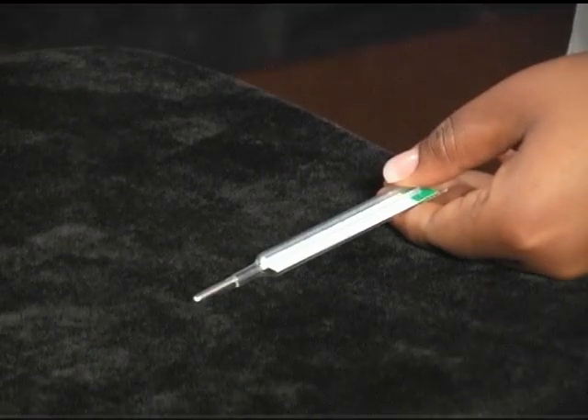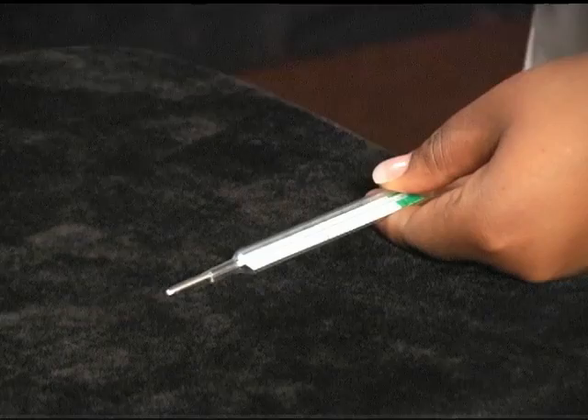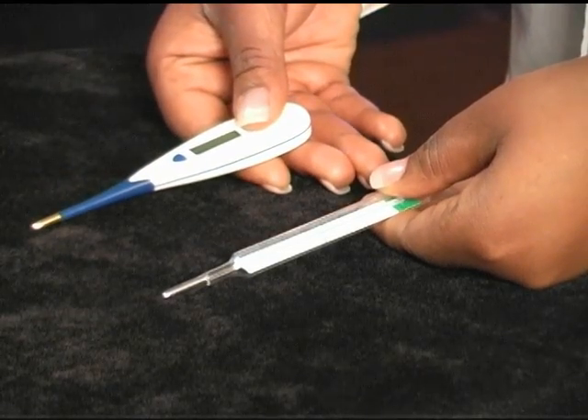Glass thermometer looks like this and digital thermometer looks like this. It is important to clean the thermometers before and after taking the body temperature using any of the methods that we are going to talk about. You can do this by using soap and water or using alcohol. Before taking the temperature, first wash your hands with soap and water.